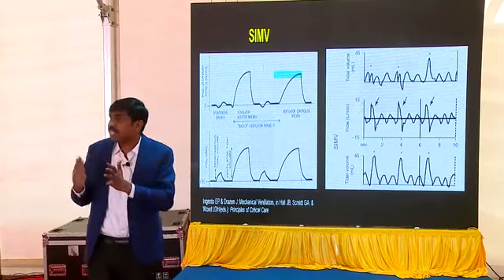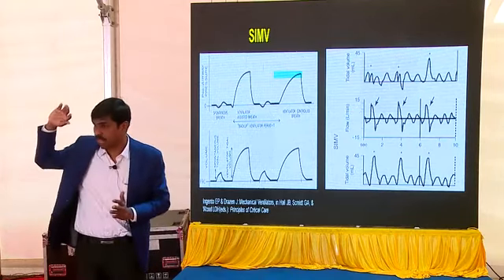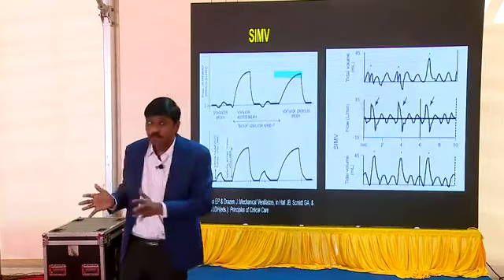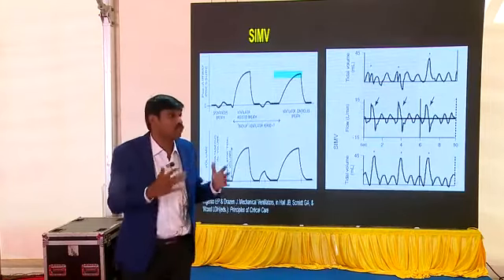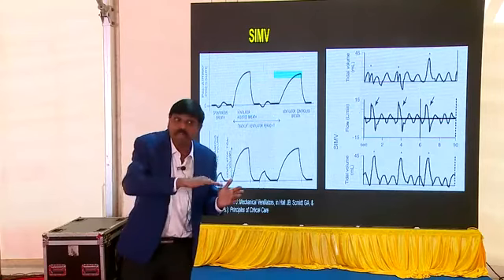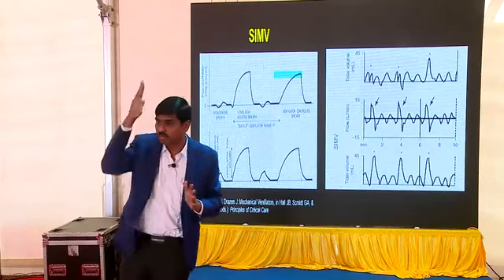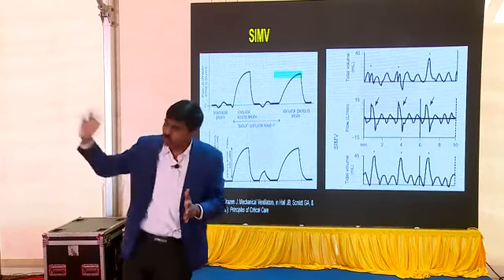Once the baby starts, it immediately synchronizes with that. Now, out of the window period, it won't synchronize. But at least it waits for the baby to tell, okay, it's going to start breathing. If it starts breathing, immediately it catches on to that. And then expiration will be based upon the time only. Once the time is over, okay, 0.3 seconds over, it moves to expiration.